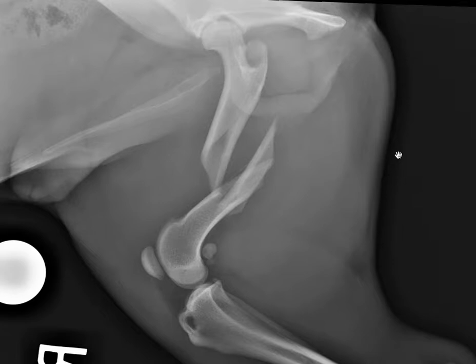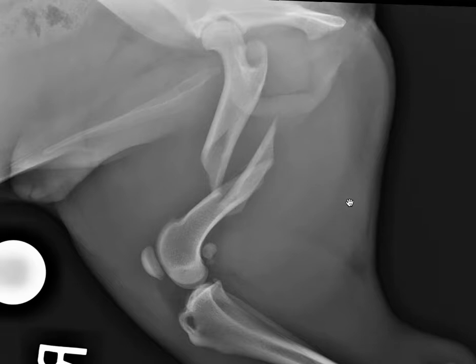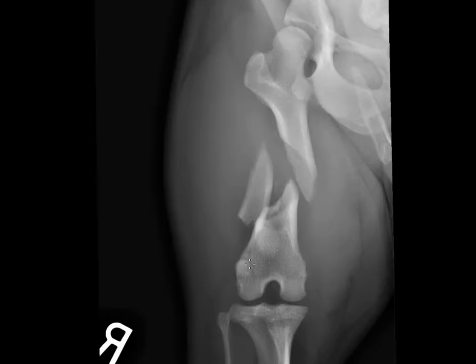For this fracture, I would say: in the mid-diaphysis of the right femur, there is a comminuted fracture with a large butterfly fragment, which is this piece here. Moderate caudolateral displacement — I conclude caudal based on this view, and I conclude lateral based on this view. Here's our butterfly fragment.